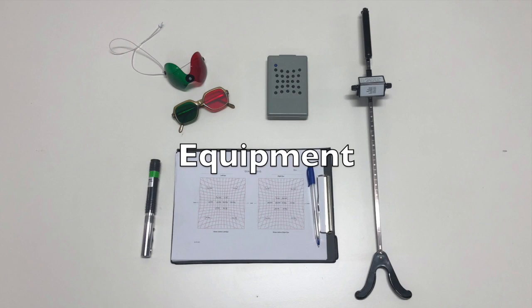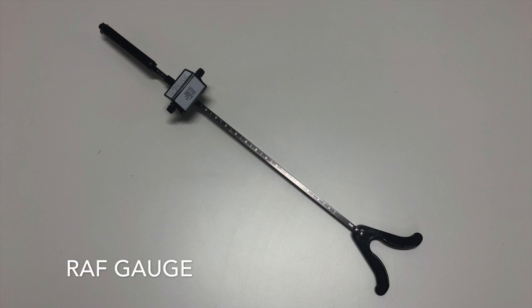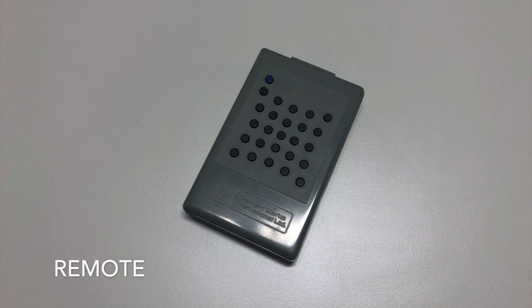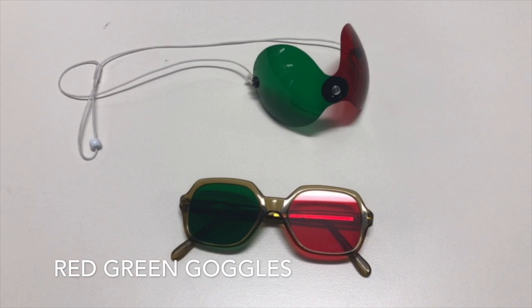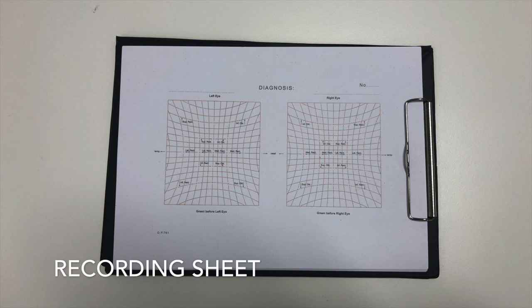In order to perform the Hess screen test, a range of equipment is required. This includes a green torch, which is held by the patient, a RAF gauge used by the examiner to measure the distance between the chart and the patient, a remote, which controls which position of gaze is illuminated on the screen, red-green goggles that the patient wears throughout the assessment, and a recording sheet to record the results.